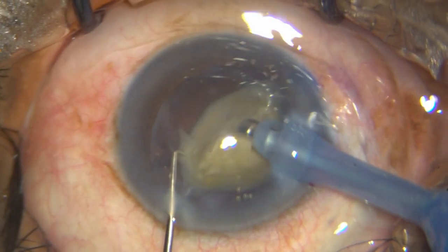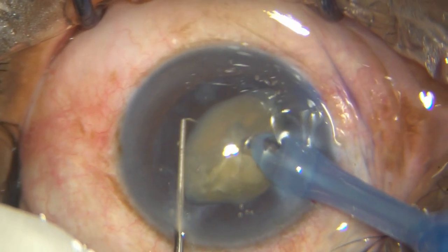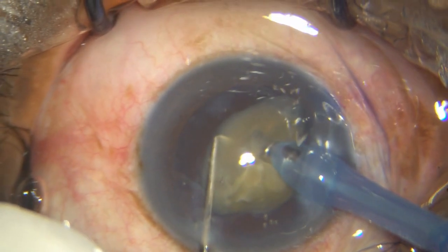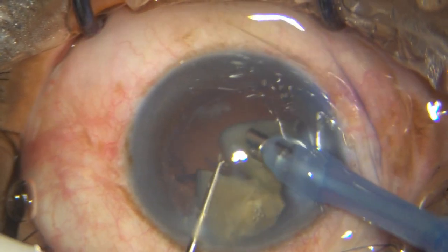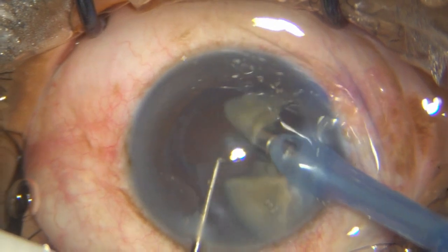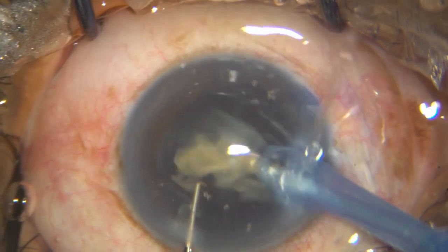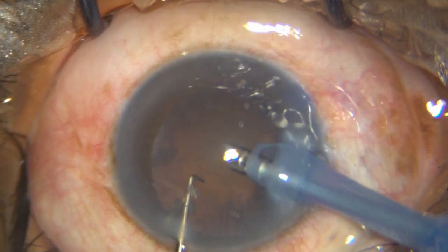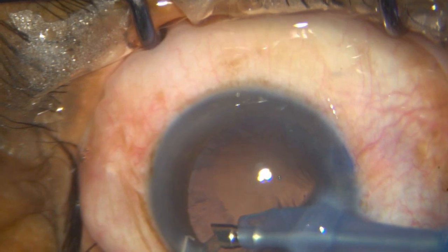This last piece is a little bit big, so I stabilize it with my chopper by digging into it and making it into 2 pieces. Before it separates, I eat off one and then target the other. This is how you have to control your Phaco emulsification and not allow the pieces to fly around.